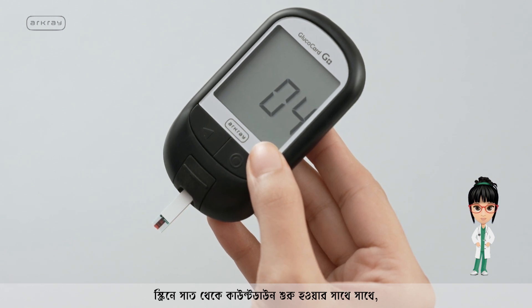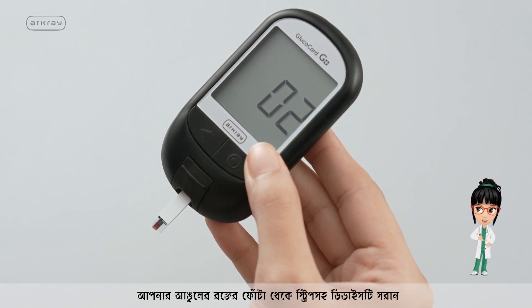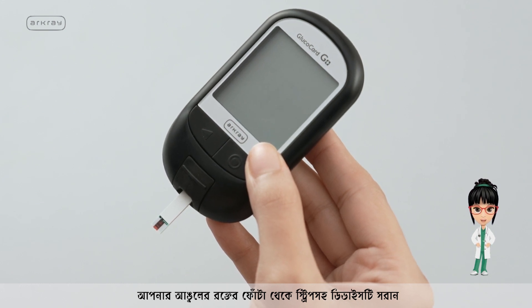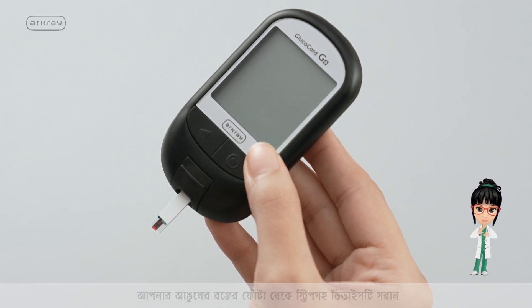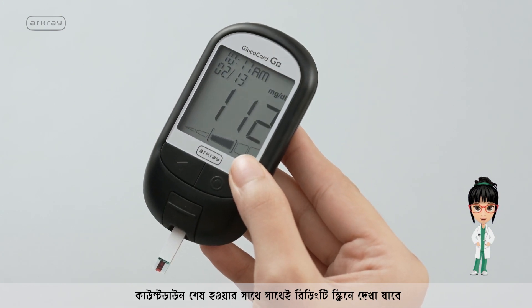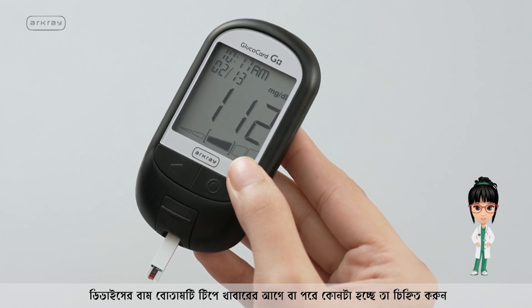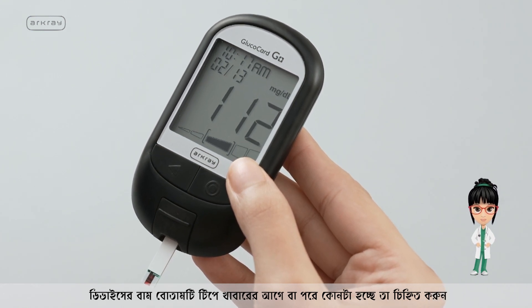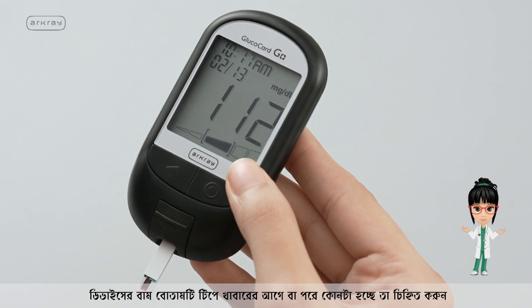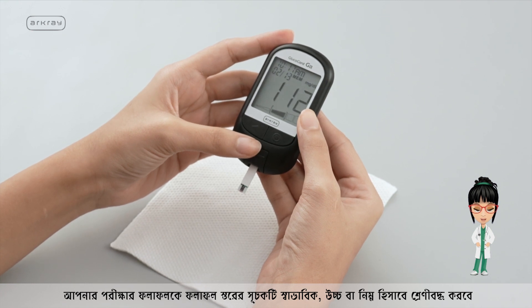As the countdown from 7 begins on the screen, remove the device with the strip from the blood drop on your finger. The reading will appear on the screen as soon as the countdown ends. Press the left button on the device to mark whether the result is before or after a meal. The Result Level Indicator will classify your test result as normal, high, or low.